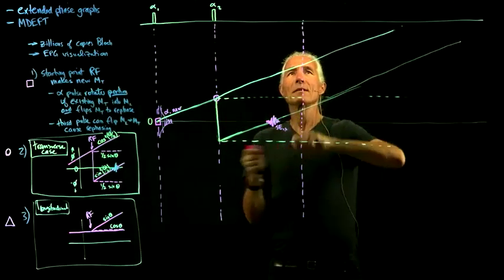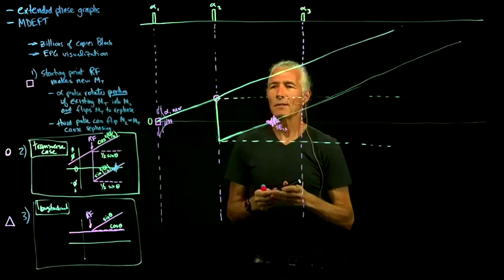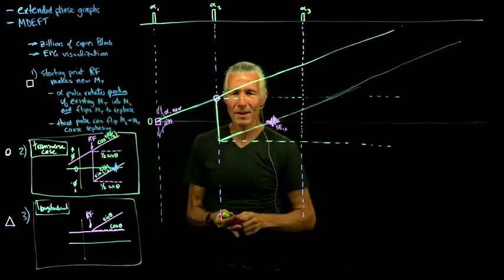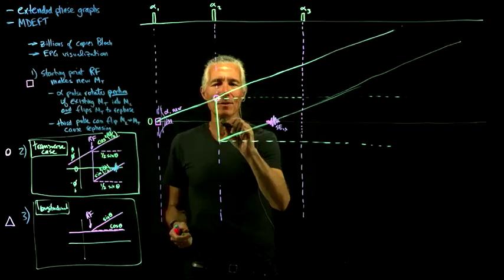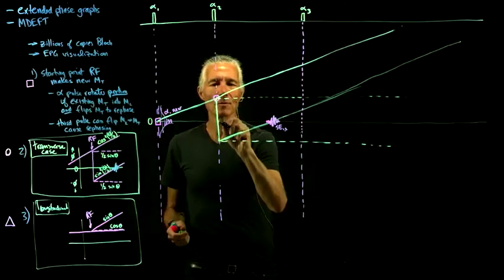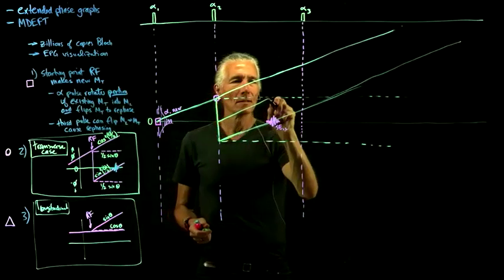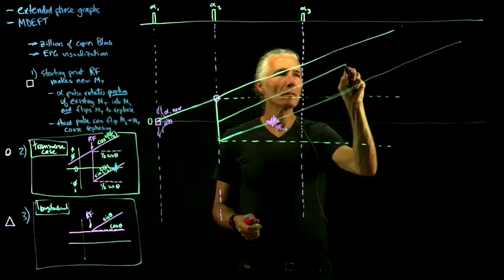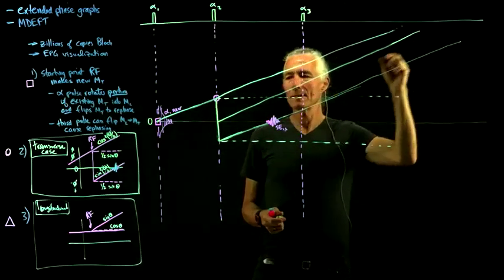But here's our third one. Sorry, there's one pathway that I left out. So let me go back to number 2. We also created with this one some new transverse magnetization that started to get dephased.